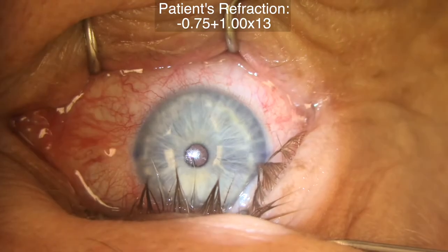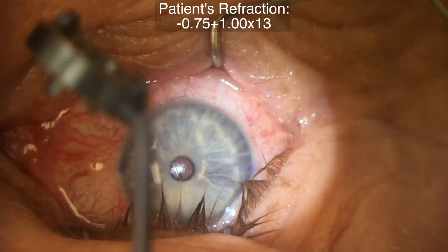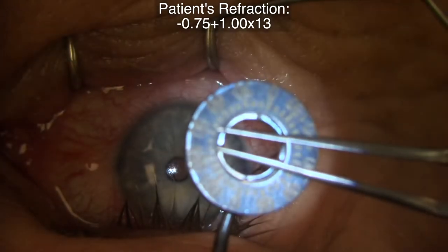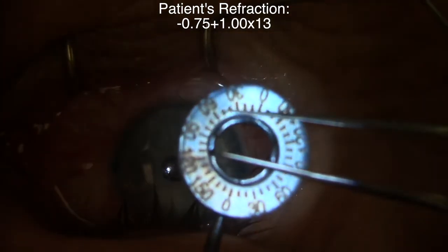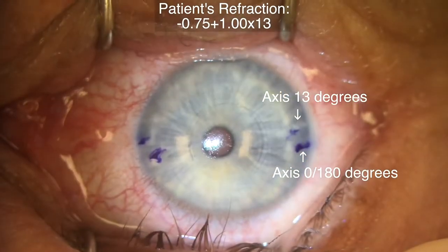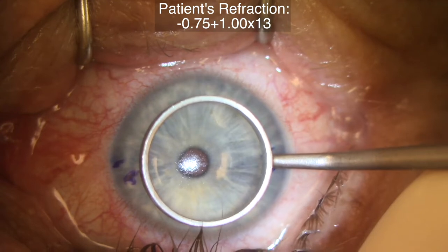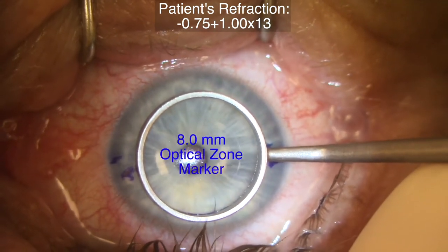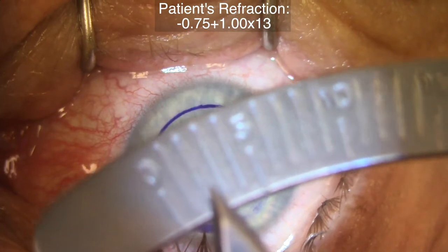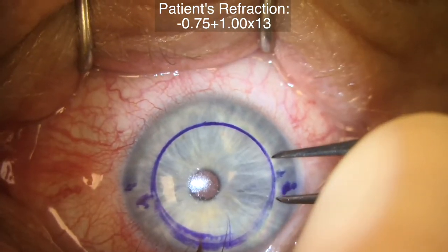So again, this patient has a refraction of minus 0.75 plus 1 at 13. We mark the cornea with an 8 millimeter optical zone marker painted with gentian violet ink. Then we mark the steep axis of astigmatism with an axis marker. Finally, we mark the length of the incisions straddling the steep axis. In this case, 1 diopter of flattening is desired. We set our calipers to 2 millimeters and then place the mark straddling the steep axis.